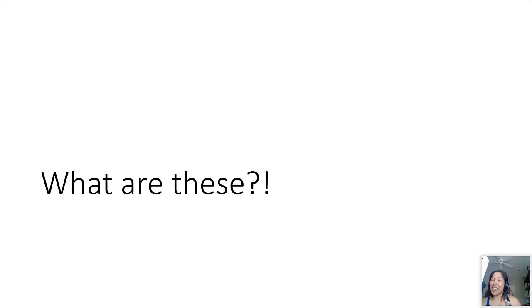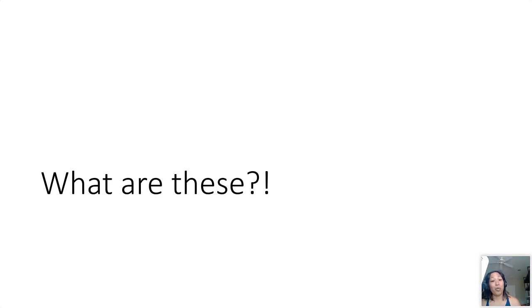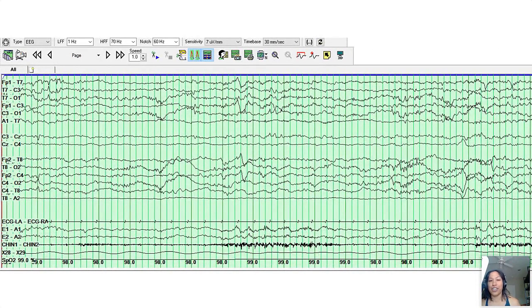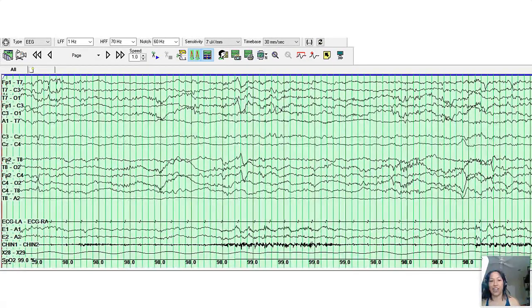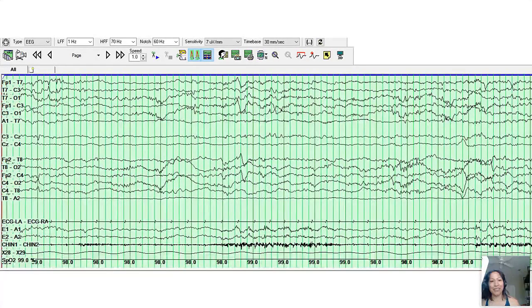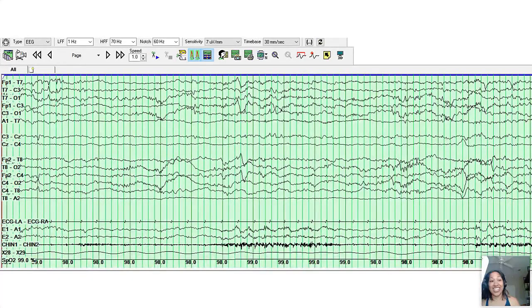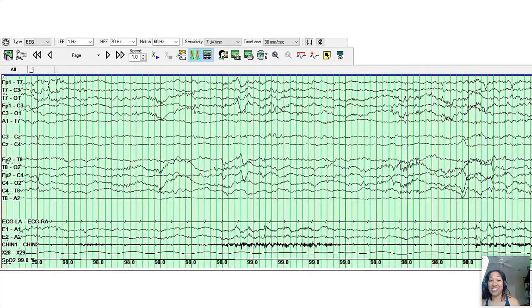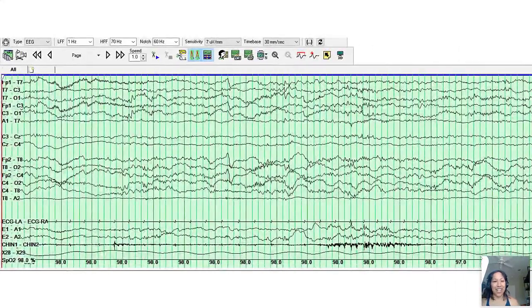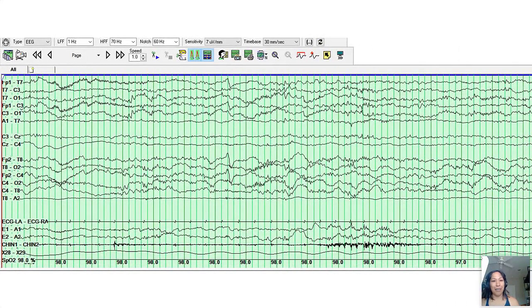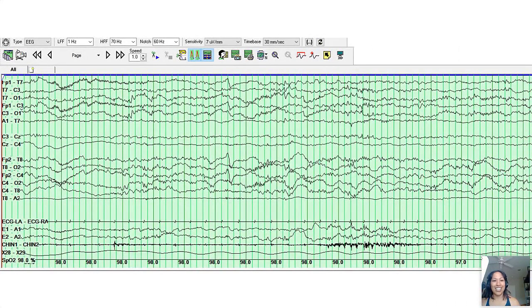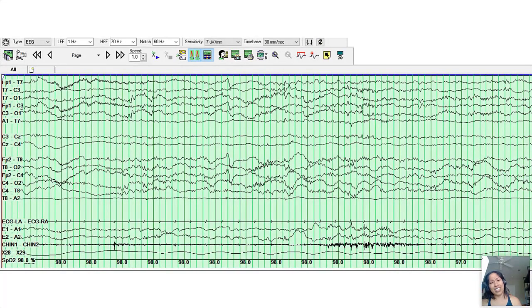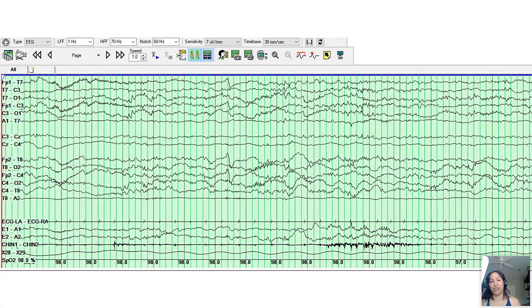Because apparently neonatal EEG was invented by French people, so the terminology is in French. So that would be a normal waking background with activité moyenne, which is average activity. So next I wanted to point this out—some normal features of a neonatal EEG which might not look so normal if this was in an adult. All right, so here's an example. I don't know if you guys can see my arrow, but in the middle of the screen there's these kind of negative deflections in the bi-frontal regions, kind of FP1, FP2, but kind of sharply contoured.